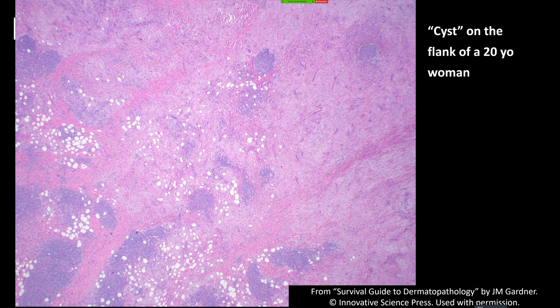At low power, my former fellow Dr. Betsy Uhlin-Hake liked to say 'pink and blue, baby' — so shout out to Betsy. At low power you have pink and blue areas: sheets of pale pink or even gray, which are the Rosai-Dorfman histiocytes, punctuated by nodules of blue — those are lymphocytes and plasma cells making aggregates and sometimes even germinal centers.